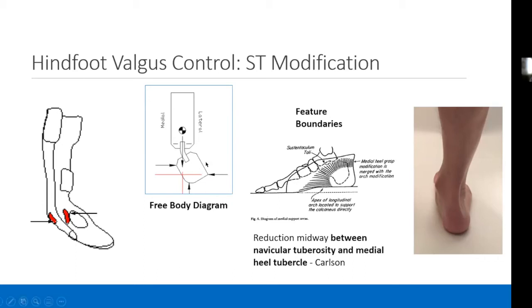And so an intimate fit between the heel cup and the heel, I think, is very important when designing this particular modification, if it's going to be effective. There's a certain amount of severity, as I was saying a moment ago, after which there's a diminishing return. You can increase and gain control, but at a certain point you don't gain more control, you just start gaining discomfort. So the question is, how severe does this need to be, and how do you balance that against comfort?